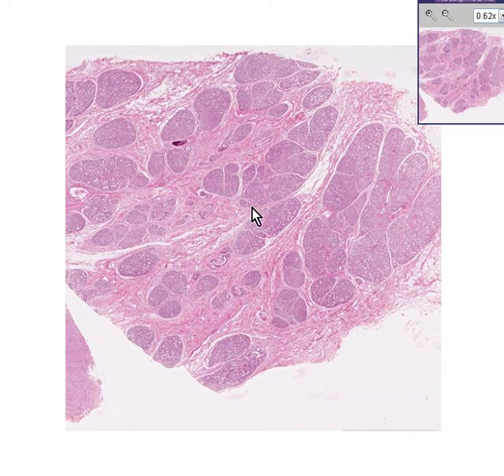A good rule of thumb is to look at the blue areas, which are the lobules and the acini in the lobes, and compare them with the pinker stroma. So here are the glands, and here is the stroma. Normally, for purposes of rule of thumb, let's just say it should be about 50-50. Now, in a woman who is postmenopausal or atrophic, there will be a lot more stroma, or the pinker area, than there will be glands. In a person who is premenopausal and non-pregnant, let's say the ratio should be about 50-50.